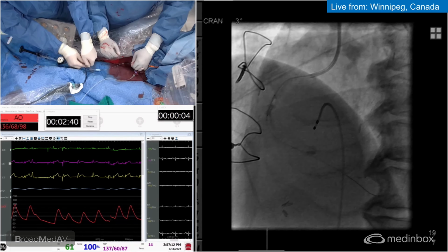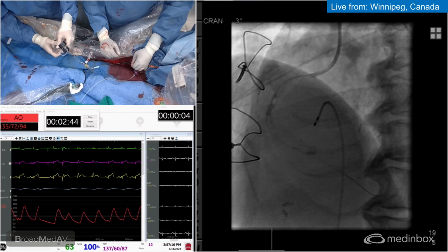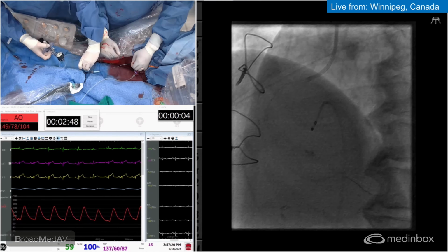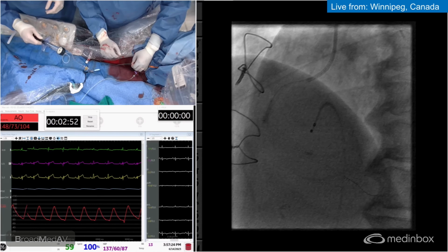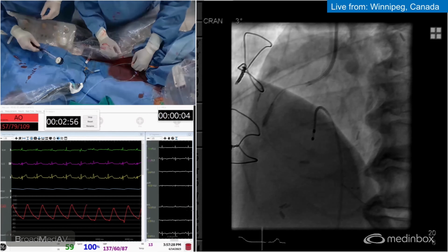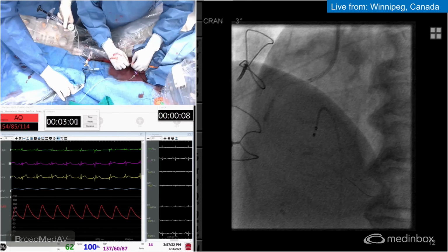The balloon needs to be prepped without air to be able to deliver the energy. But even despite that, you can see the balloon looks more symmetrically expanded than on your first inflation. So you've modified the plaque to some degree already. You can see it there. This is the spot that we had issues with last time. Okay, we're going to deliver here. Yeah, beautiful, that's better. This was very underexpanded last time with the other balloon.